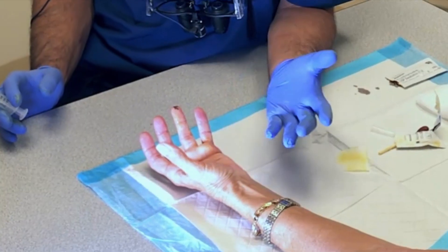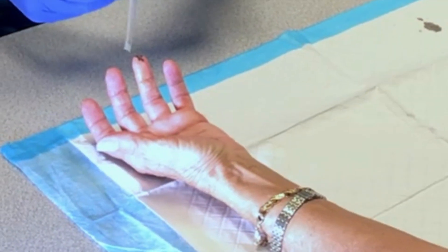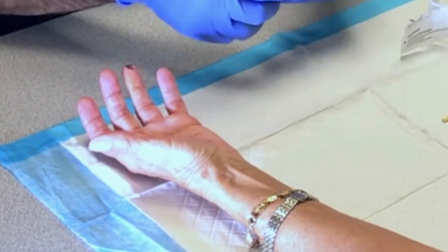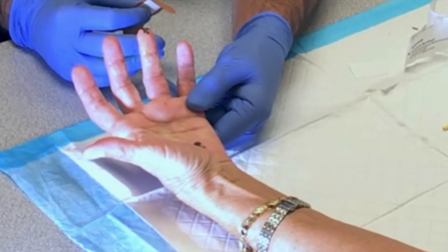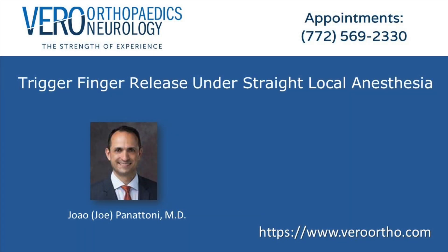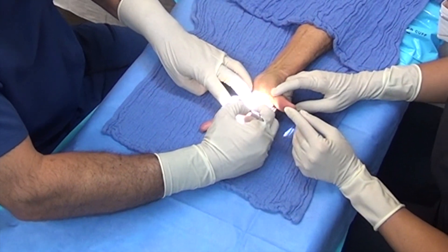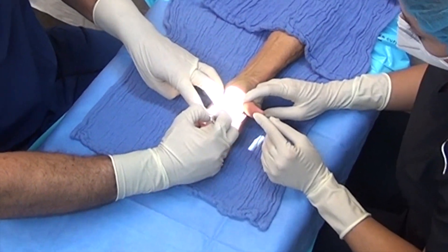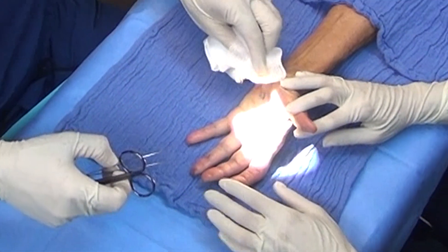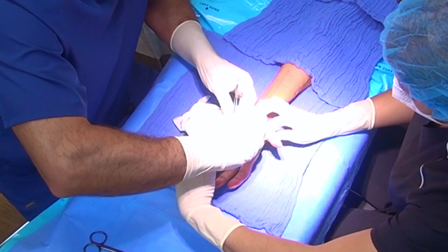This will diffuse and control the bleeding so we can do the procedure by just doing a small incision — we do this wide awake procedure without the use of a tourniquet. Very minor bleeding here, even though she's on blood thinners; the needle is so small it doesn't cause much bleeding. The left ring finger is marked and it's the correct finger, right? Yes. Are you having any pain right now? No, everything's good.